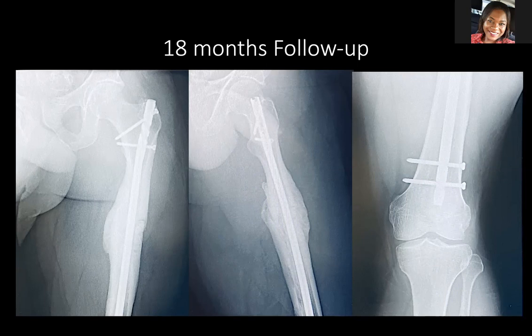And the other thing is, when you get a failure in the first scenario, like after the first implant failure, that surgeon could have still asked for a second opinion before embarking on a revision. And this as well will not take away anything from a surgeon. And thirdly, if you find an implant failing the first time, I don't think revision would have mandated that you repeat the same thing with just slightly different implants.